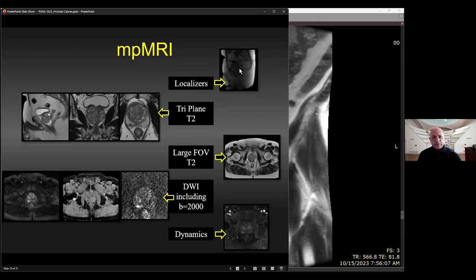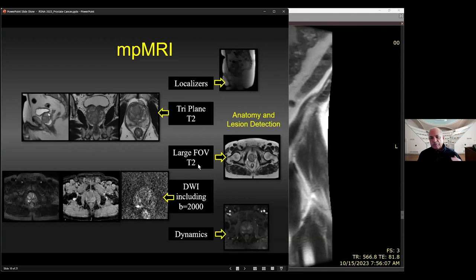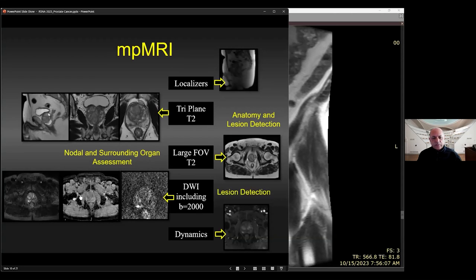The components of multiparametric MRI are: localizer, then triplane T2s for anatomic delineation, zone identification, and lesion detection primarily in the transition zone. A large field of view goes from the aortic bifurcation to the pubic symphysis to assess lymph nodes and surrounding organs for incidental findings. Then we do DWI with a low B-value and intermediate B-value, calculate an ADC from that — the ADC is essentially a slope — and from the ADC you can extrapolate higher calculated B-values. At our institution, we use a calculated B-value of 2000, which suppresses the normal gland and brings out the tumor.